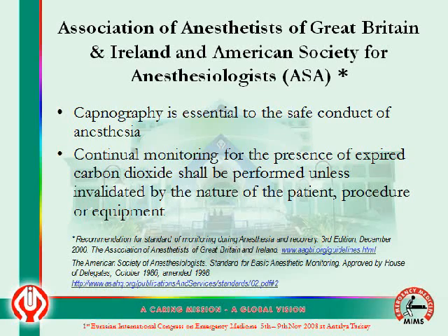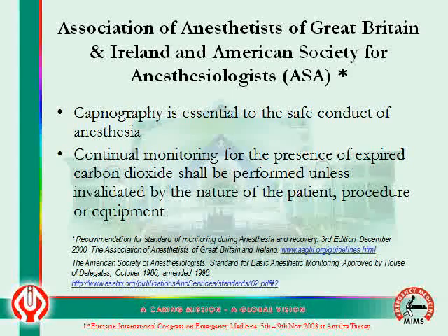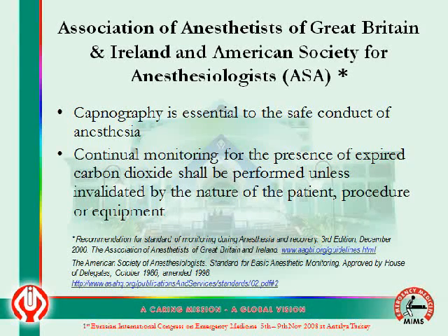The Association of Anesthetists of Great Britain and Ireland and the American Society of Anesthesiologists, that is ASA, state that capnography is essential to the safe conduct of anesthesia, and the continual monitoring for the presence of expired carbon dioxide shall be performed unless invalidated by the nature of the patient, procedure, or equipment.